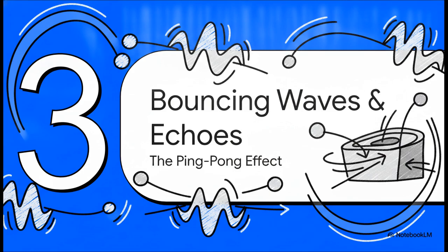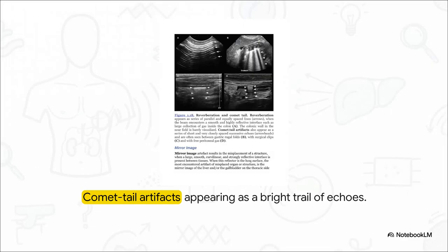We like to call this the ping-pong effect. So, what happens when sound waves don't just scatter, but actually get trapped? Here you can see reverberation, and specifically a type known as a comet tail artifact. So here's the physics behind this specific hallucination. The ultrasound beam hits a highly reflective interface, like gas in the lungs or the GI tract, and sends this massive echo straight back to the probe. But that echo is so strong that when it hits the surface of the transducer, it literally reflects back into the body, hits the gas again, and bounces back to the probe a second time. Ping, pong.